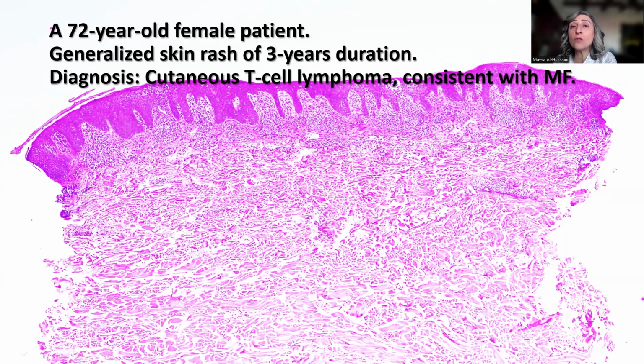Remember that in mycosis fungoides, you would see the tumor cells positive in general for CD3. There is usually, but not always, loss in particular of CD7, although this is not a mandate to establish the diagnosis. CD5 and CD2 are in general preserved or maintained.